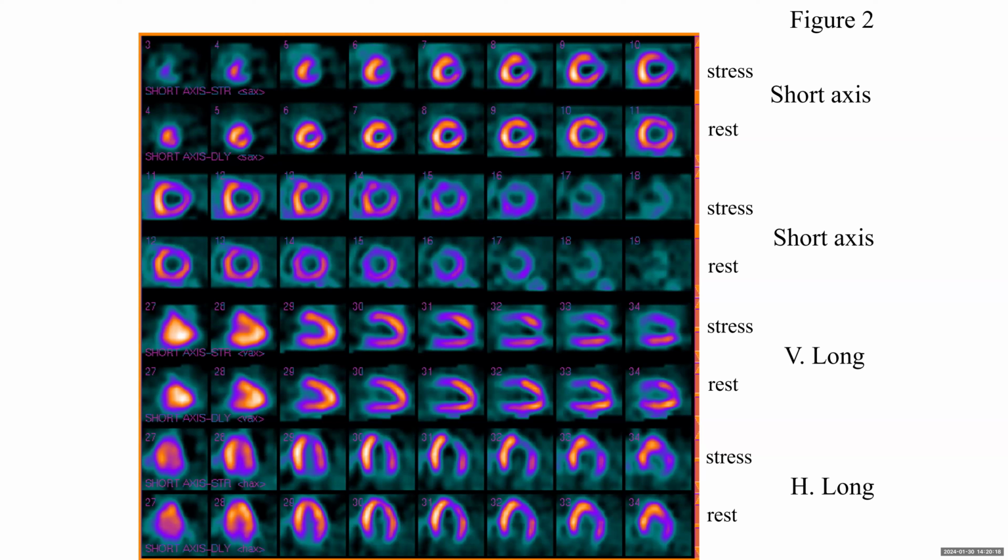So what is the cut limit for TID? Then 1.2. Yeah, 1.3? 1.2 or 1.3? More than 1. Okay, so 1.2, excellent. So this is for the first case.